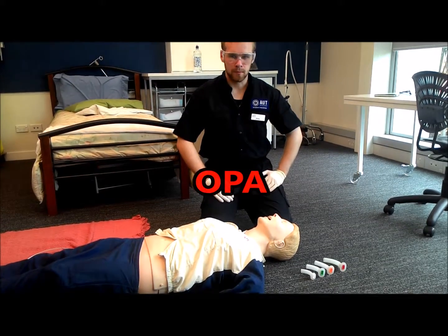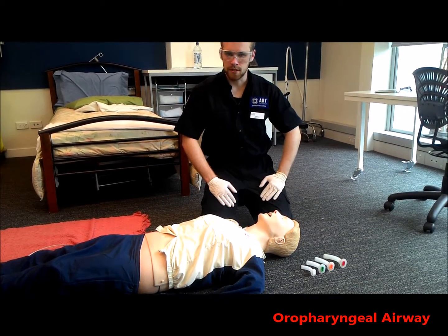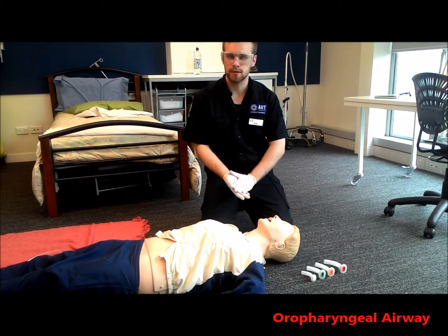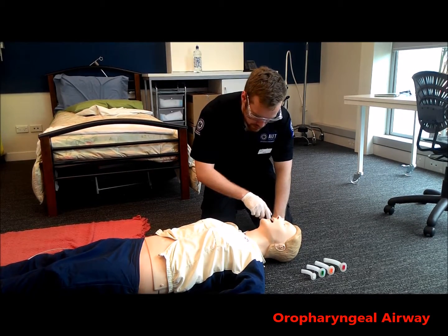So now I'm going to show the proper use of an OPA or oropharyngeal airway. This is indicated when the patient has a GCS of 8 or lower or scoring a 2 or less in their verbal response. Before we do anything, we want to check that his mouth is open and the airway is clear of any obstructions.